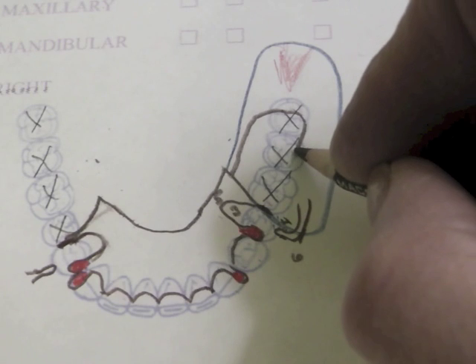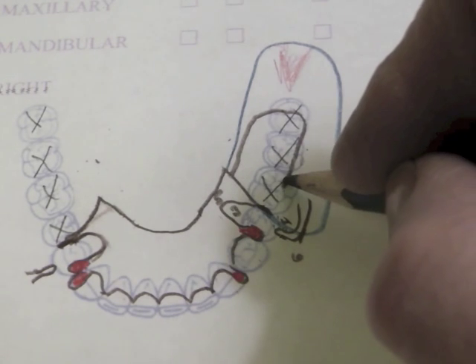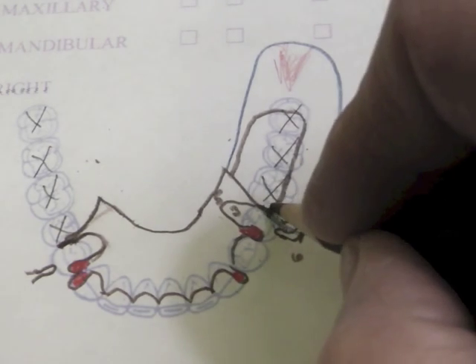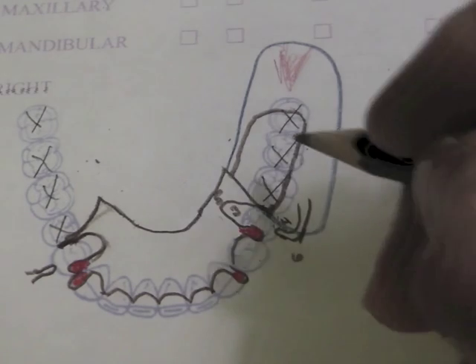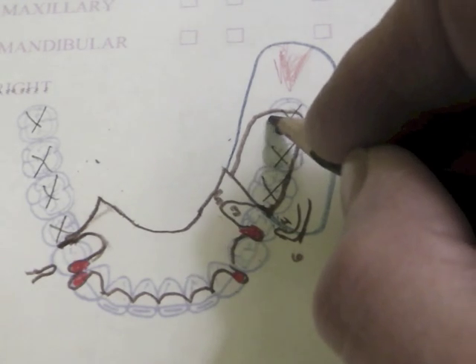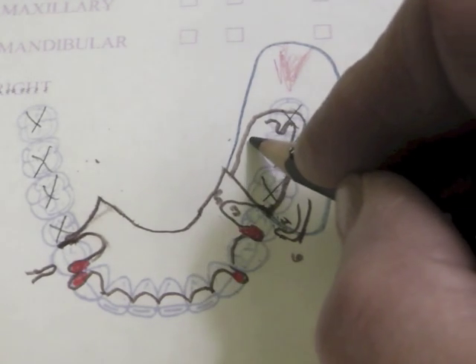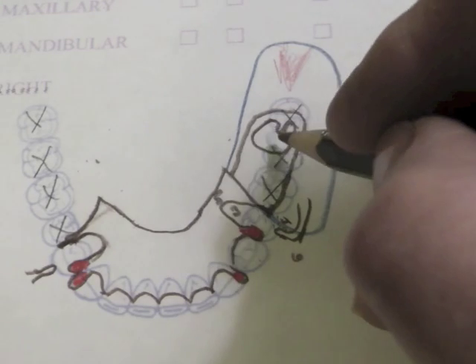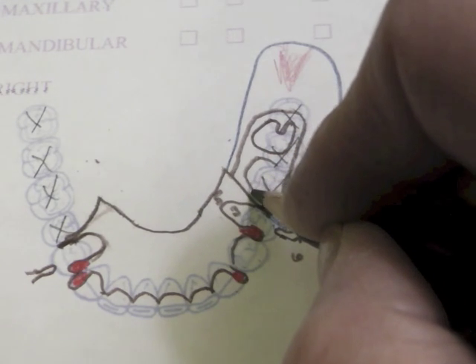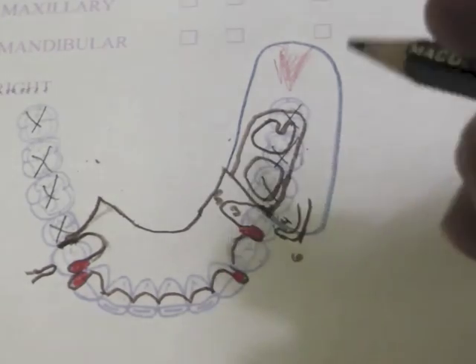Then it comes slightly over the crest of the ridge — not too far down, because we want to butt some teeth up against the ridge here to get the angulation on the teeth correct. This comes up to our guide plate coming down the side of the tooth. Inside of that we create a tissue stop, or processing stop as it's sometimes called — metal parts with big holes in them to retain the acrylic resin. This is our base attachment.